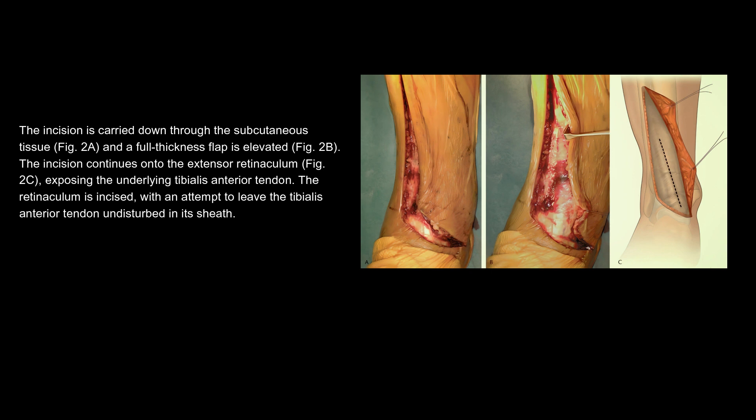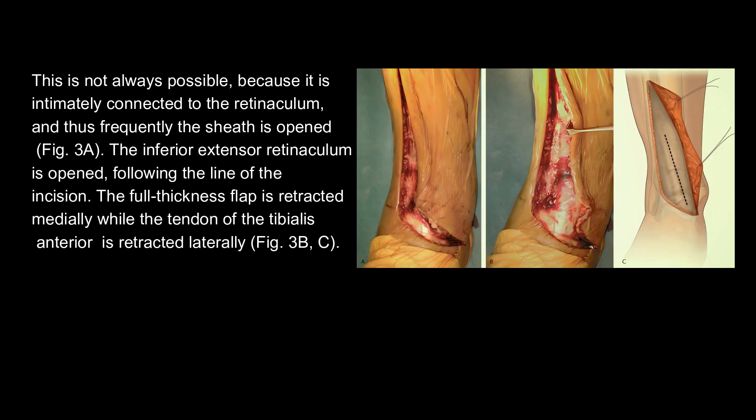The incision is carried down through the subcutaneous tissue, and the full thickness flap is elevated. The incision continues onto the extensor retinaculum, exposing the underlying tibialis anterior tendon. The retinaculum is incised, with an attempt to leave the tibialis anterior tendon undisturbed in its sheath. This is not always possible, because it is intimately connected to the retinaculum, and thus frequently the sheath is opened. The inferior extensor retinaculum is opened following the line of the incision.